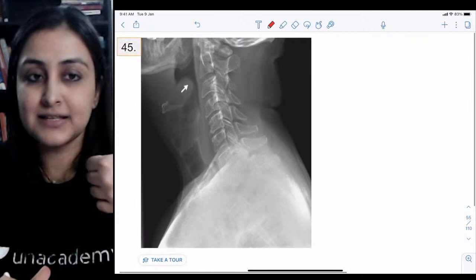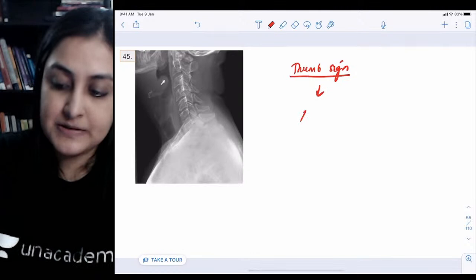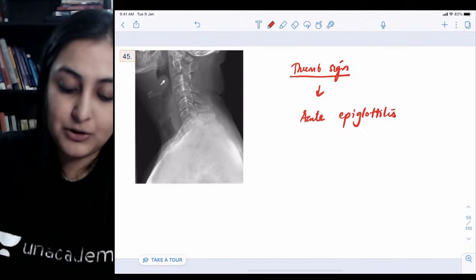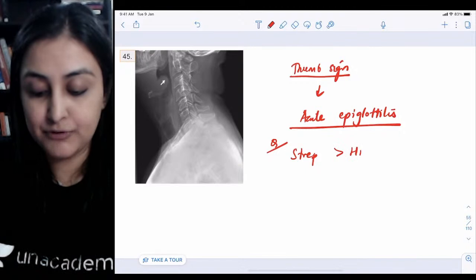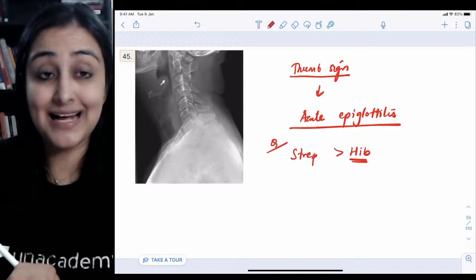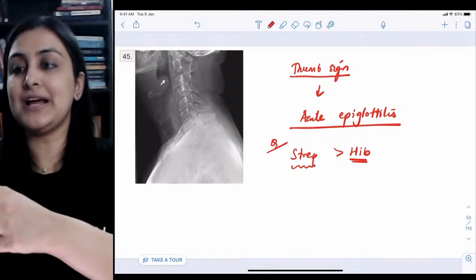Next is a very classic question — you can see a thumb projecting into the trachea/airway. This is the thumb sign, representing inflammation of the epiglottis — acute epiglottitis. The causative organism is bacterial. The most common cause is Streptococcus, followed by Haemophilus influenzae type B, which was previously most common but is now vaccine-preventable. Streptococcus being most common was a repeat FMG question.